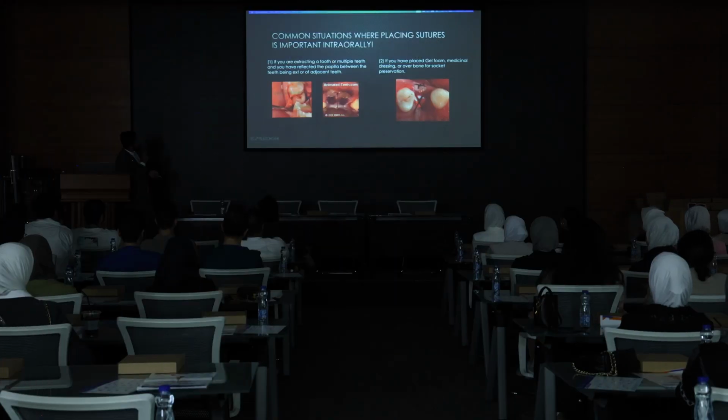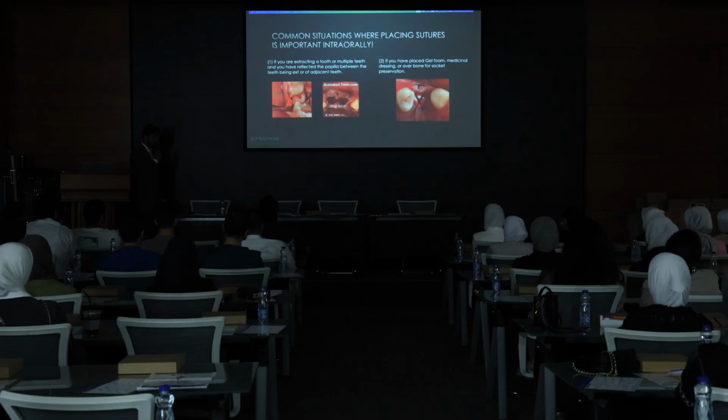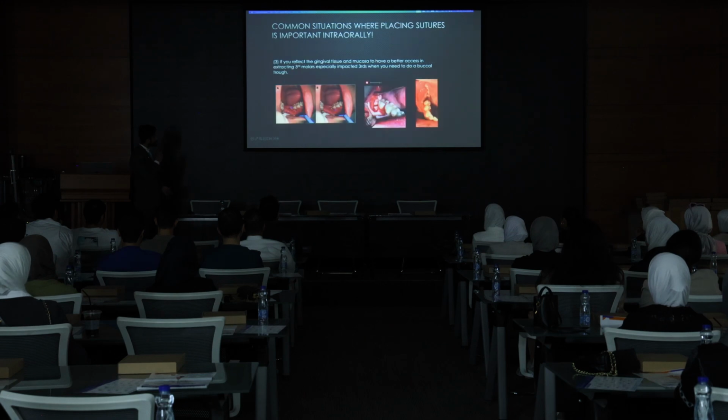Common situations where placing sutures is important intraorally. Whenever you're extracting multiple teeth and you've reflected the papilla between the teeth being extracted, or even the adjacent teeth, if you place some kind of material inside, Alvogyl, Surgicel, Gelfoam, or any medicinal dressing, and if you place some bone or membrane inside the socket, you want to secure that, keep it in place.